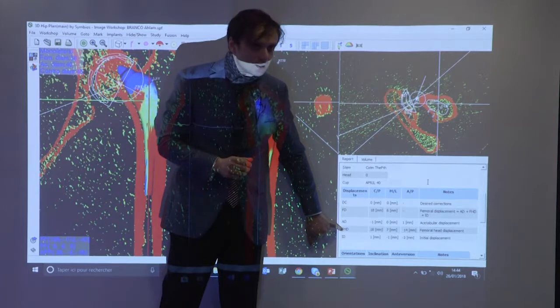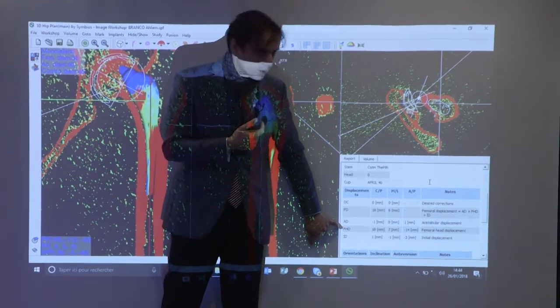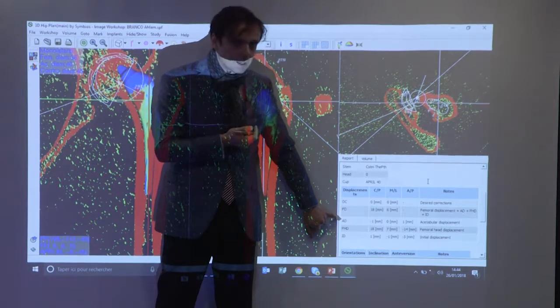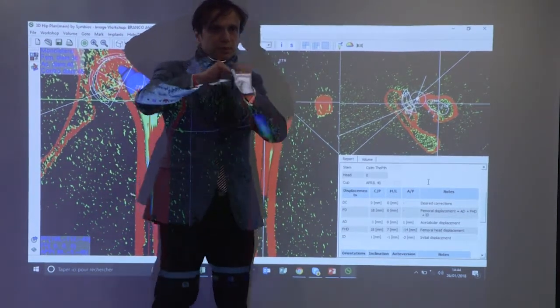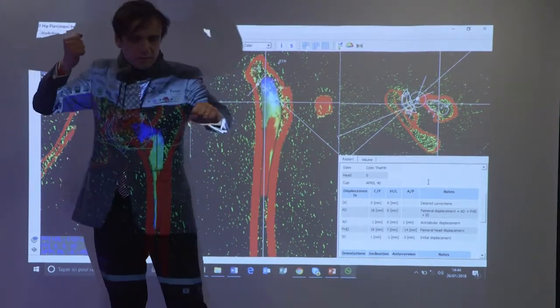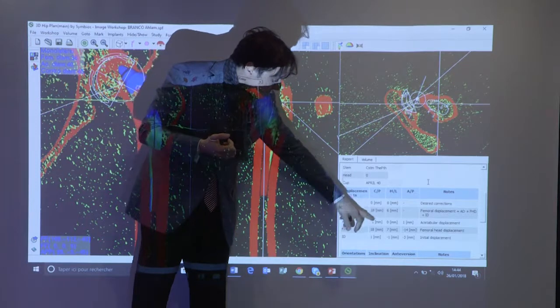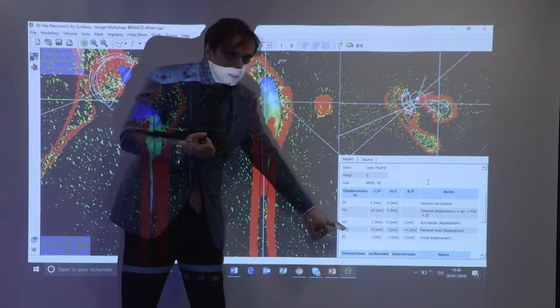Basically, this is what is due to our surgery. Because of the reaming procedure, we will alter the position of the center of rotation, so we will induce an acetabular displacement. Usually, it's a shortening, posterior shift, and medial shift. Usually we always ream the same way, posteriorly, cranially, and medially. But we try to compensate for this acetabular displacement by a femoral head displacement.